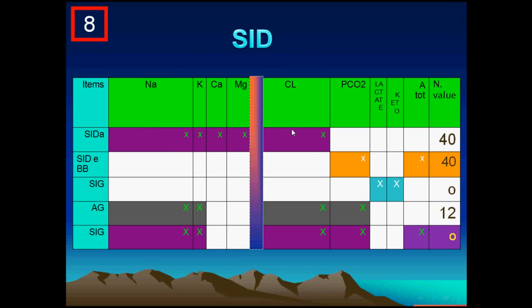Chloride is 102, the difference is 40. This 40 doesn't mean that sodium for sure is more, but this difference equals that value. This difference is the part of the anion that should be added to the chloride in order to equal this cation.